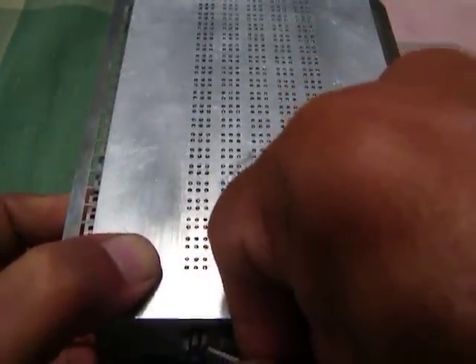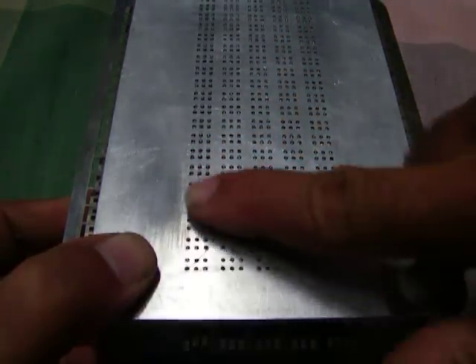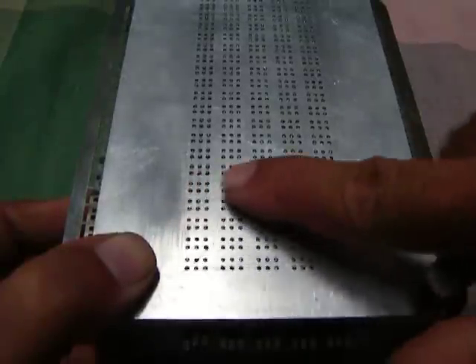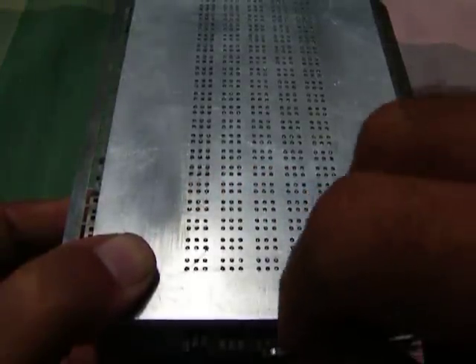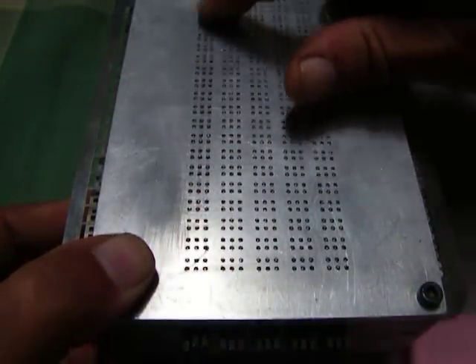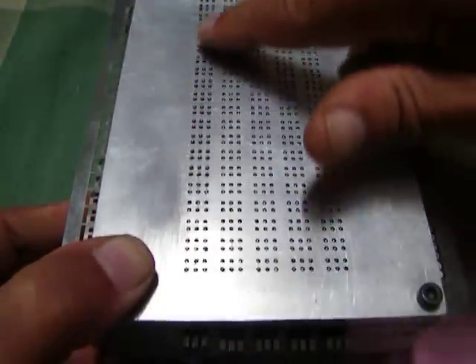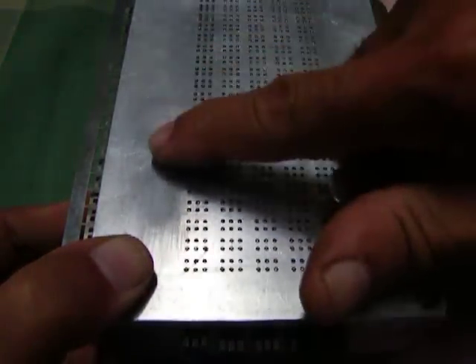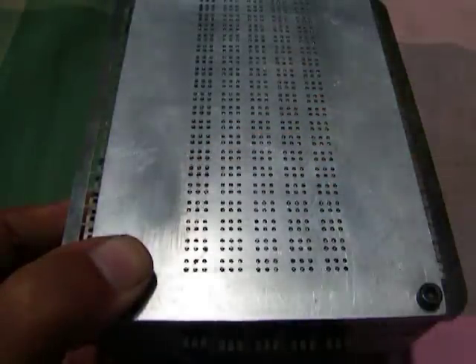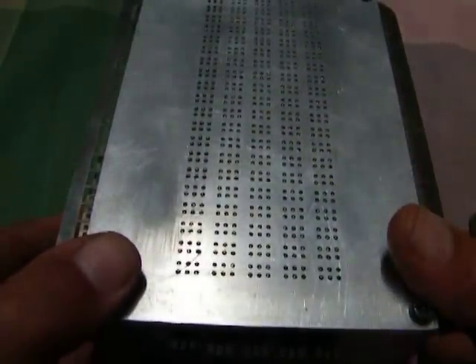Now for the third row, up. So what I've done is I've locked the first five cells, they are latched. So there's no effect at all with any of the cells over there. So no matter what you do with the row actuators, nothing happens. Only for the cells where the latches are open, they jump up. So I've got all the pins up for cell 6 onwards, 6 to 20, all up. 1 to 5, nothing, no activity. So that's basically how a row and column actuator work.